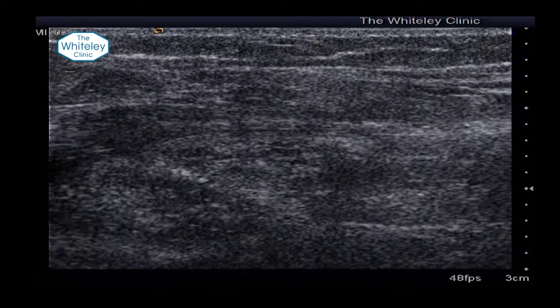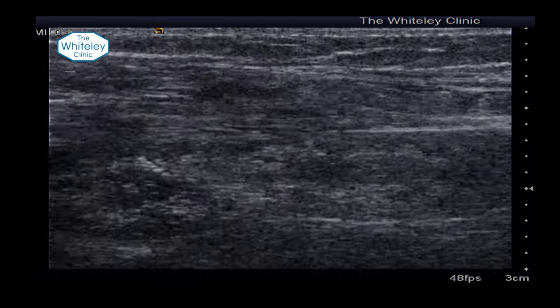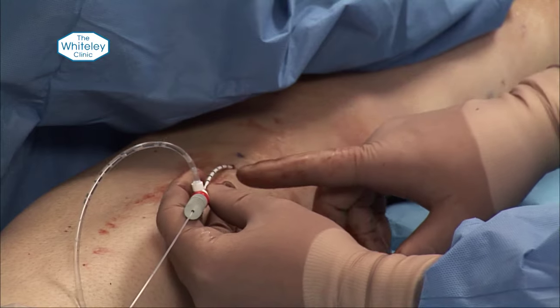It's about a 2cm gap between the end of the fibre and the junction — so that's a nice safety margin. We're just going to measure it here in real time so you can see how far it is. It's 17mm, which is perfect — we're happy with that. We don't want to get closer because it is forward firing, so we mark on the outside and see what it is.